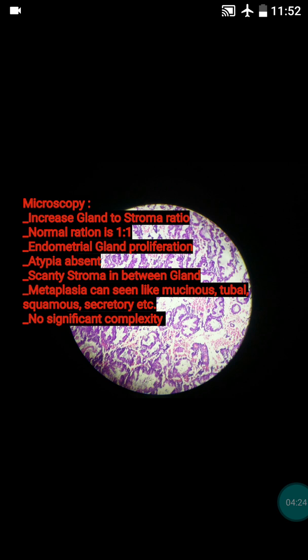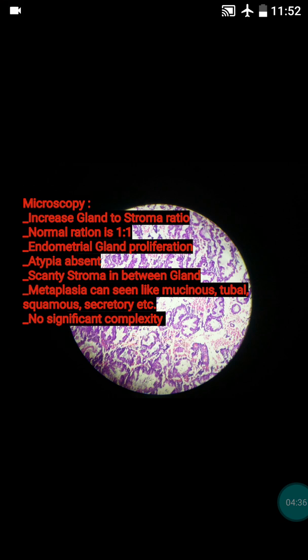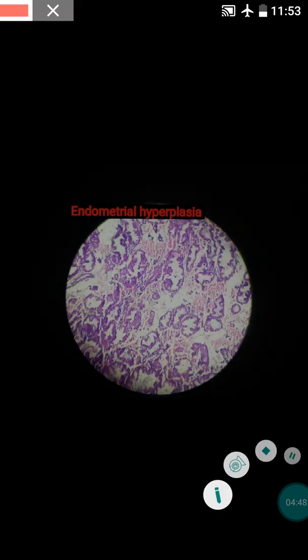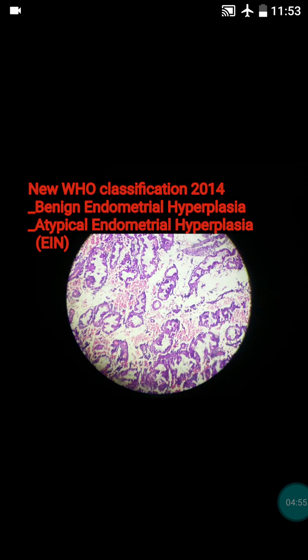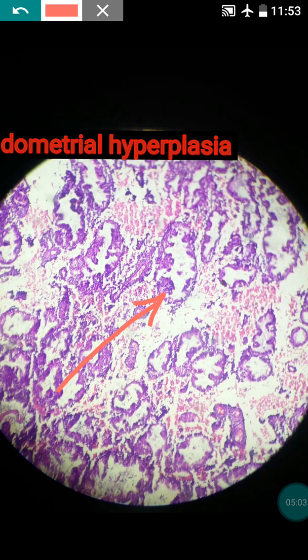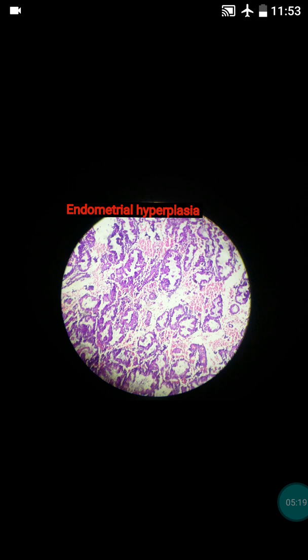In benign endometrial hyperplasia, the proliferated endometrial glands are not complex and atypia is absent. If it is atypical, there will be complexity and more atypia. In this benign case, the diagnosis is straightforward — increased number of glands with no atypia. The lining cells are not atypical; you can see some infolding in the glands, but atypia is typically absent.